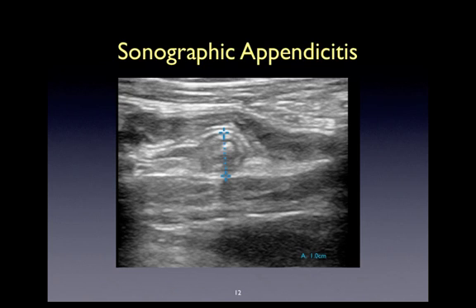Now we're going to review several examples of appendicitis. Getting comfortable with what appendicitis looks like sonographically will allow you to become more confident with your ability to identify appendicitis at the bedside. In this example, we can see a targetoid structure measuring 1 cm. You may also appreciate a very subtle hyperechoic structure in the middle of this appendix, and some very scant posterior acoustic shadowing. In this example, there is also the presence of an appendicolith.